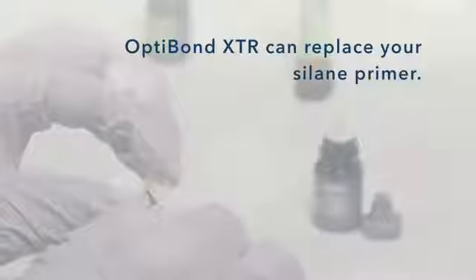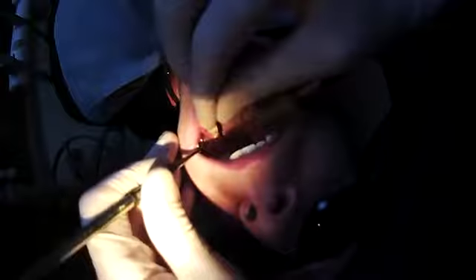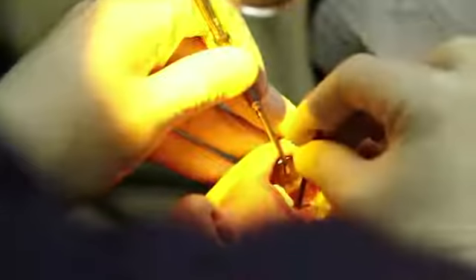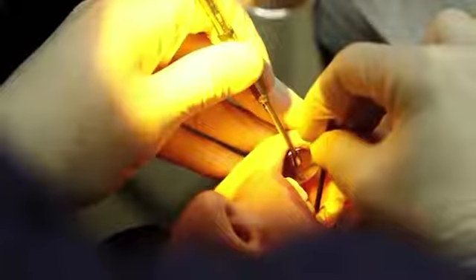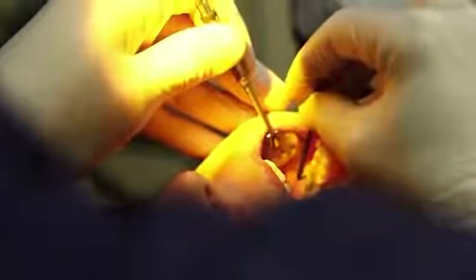Okay. We're now going to use part 1 on the tooth for 20 seconds. If you use an overhead surgical light, it would be wise to filter it, because you will start curing your bonding agent ahead of time. We leave retraction cord in whenever possible. It makes cement cleanup much easier. This goes on for 15 seconds. So when you're using part 1, the dentin doesn't fully etch until you're past 15 seconds. So make sure you do it for 20 full seconds.